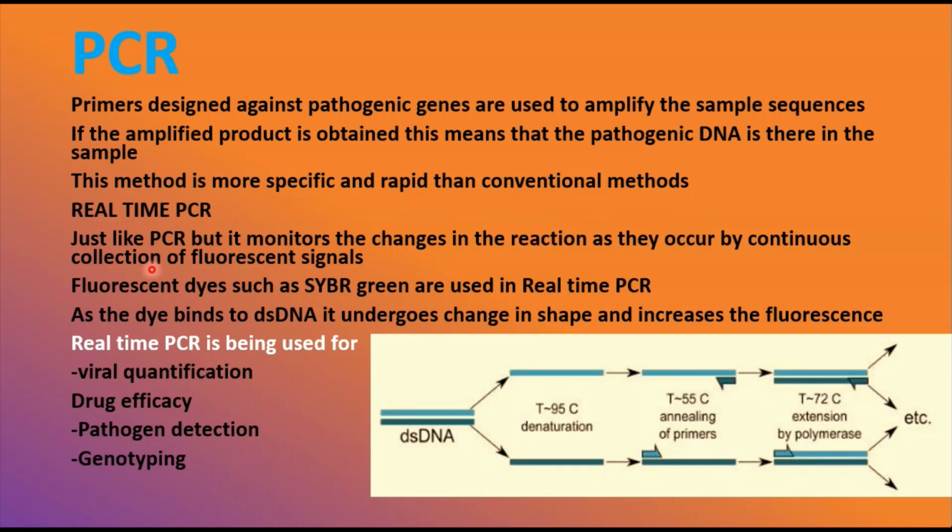all these things. Okay, so the conventional PCR relies on amplification of the target genes in a thermocycler and separation of the PCR products by gel electrophoresis, followed by visualization and analysis of the resulting electrophoretic patterns. That is a process that can take a number of hours. The specificity can be subsequently confirmed by sequencing the amplified fragment.